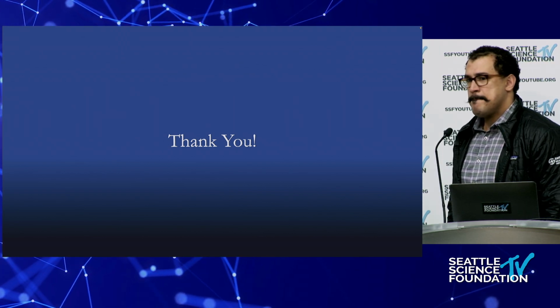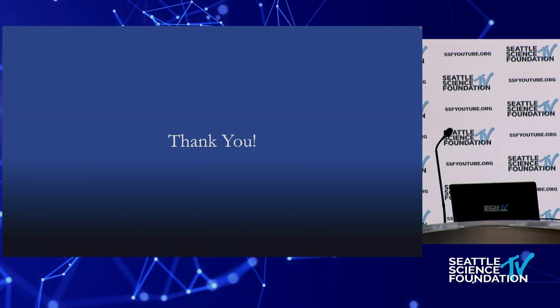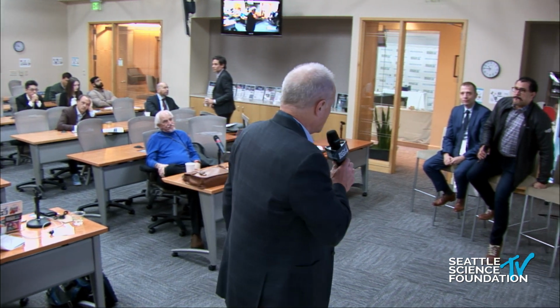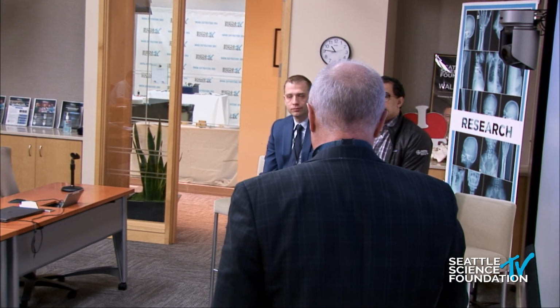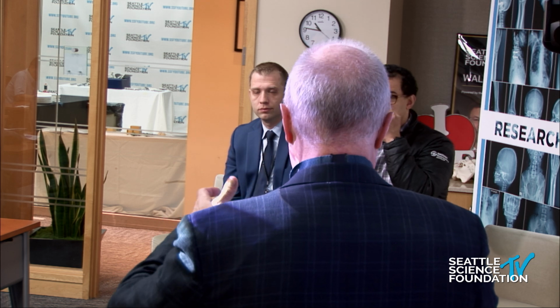So do you want to have a seat over there? And so just quick questions, and then I'll ask Ashraf to start getting his lumbopelvic talk ready. So quick questions to both of you. I'll start with you, Amir. We both use cement. You use fenestrated screws, I don't. I'm worried that I have to put more pressure during the cementing of my fenestrated screws than if I do a preload of about 1.5 to sometimes 2 cc's in a pre-manufactured screw tract.